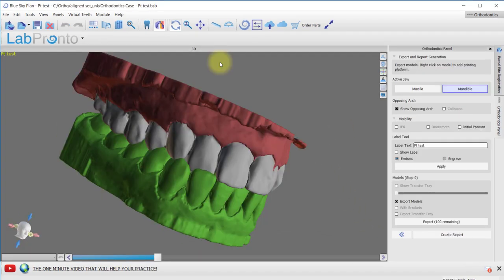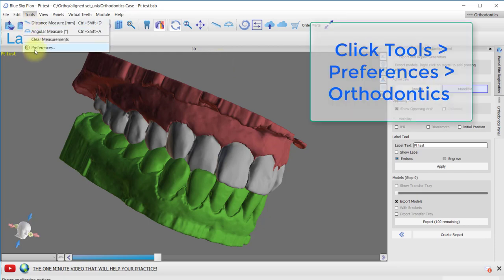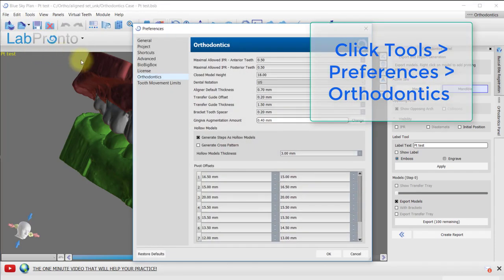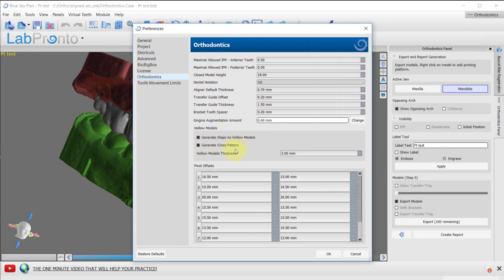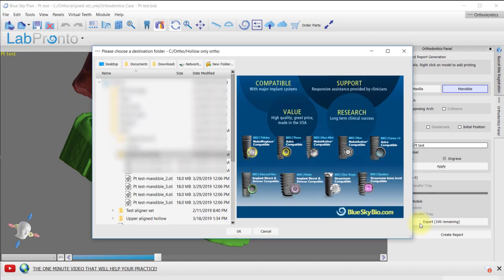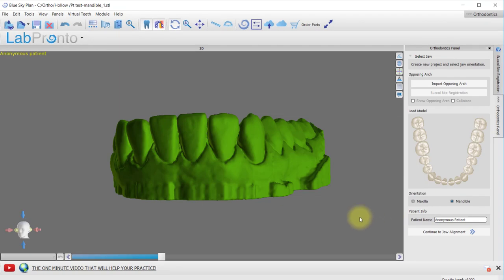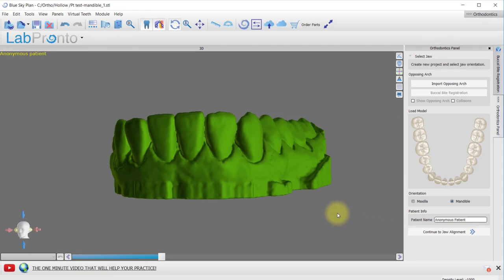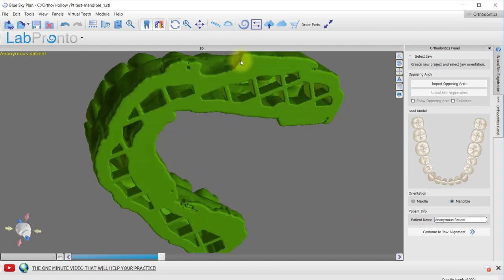In order to generate a hollow model with a crosshatch pattern base, go up to Tools, Preferences, Orthodontics, and click on Generate Cross Pattern. Click OK and Export. Here is an example of a crosshatched hollow model.